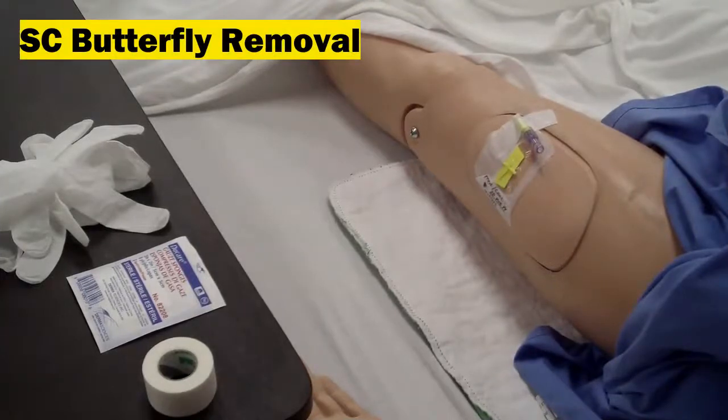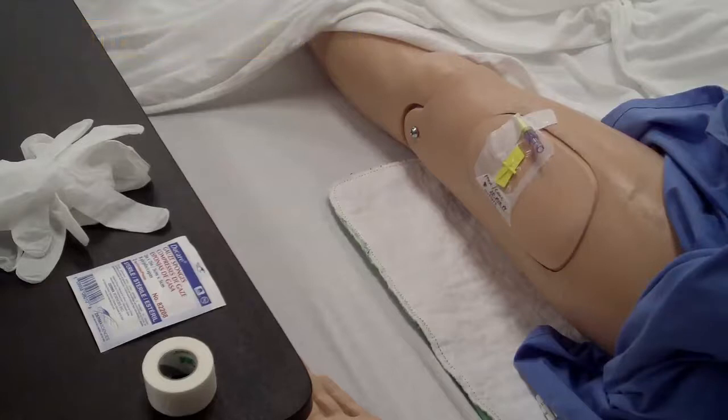Subcutaneous butterfly removal. For this, you will need gloves, tape, and gauze.